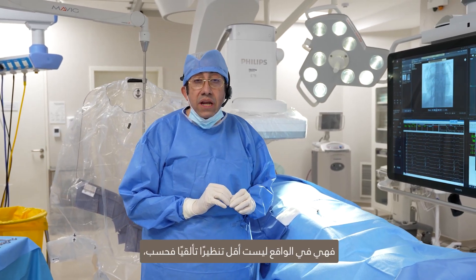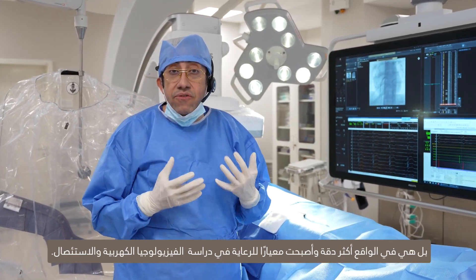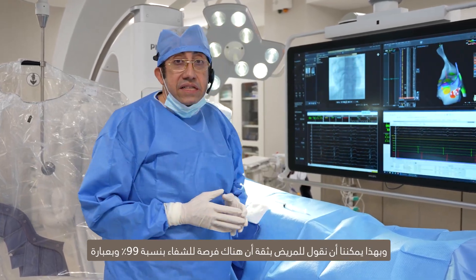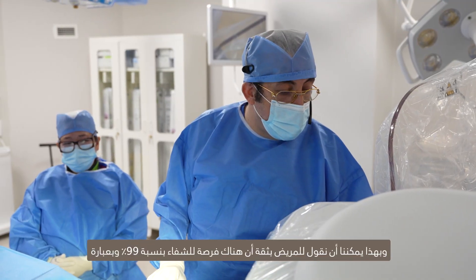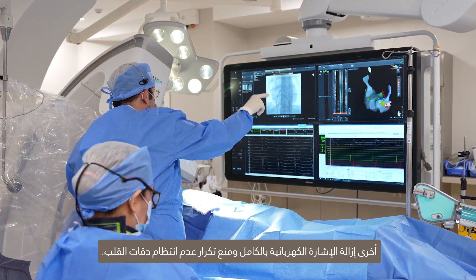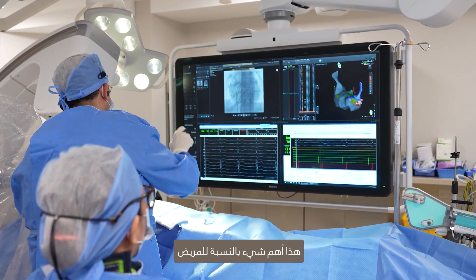In fact, it is not only less fluoroscopy — it is actually more accurate and has become something of a standard of care in EP studies and ablation. With that, we can confidently tell patients that there's a 99% chance of cure. In other words, removing the electrical signal completely and preventing the recurrence of the tachycardia, which is the most important thing for the patient.